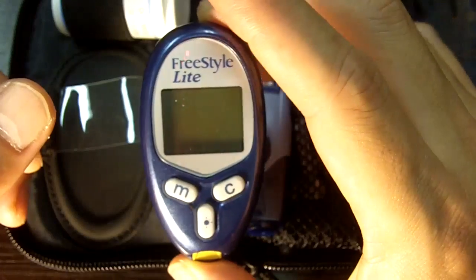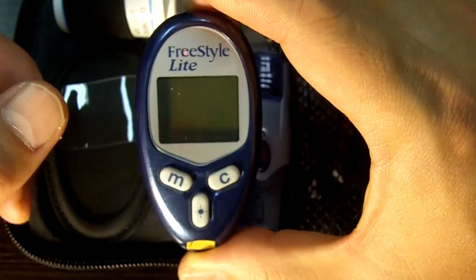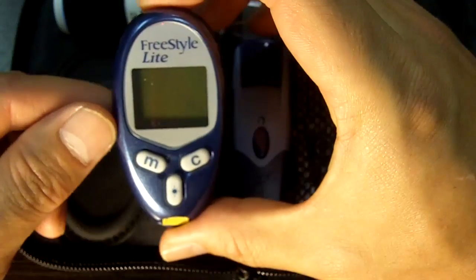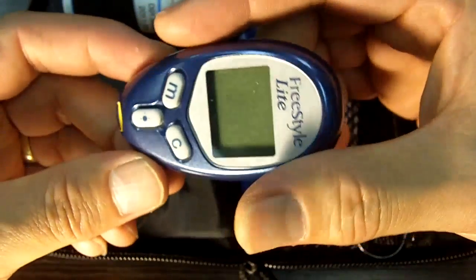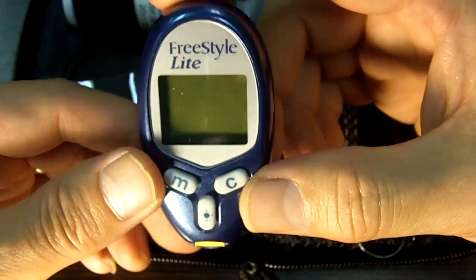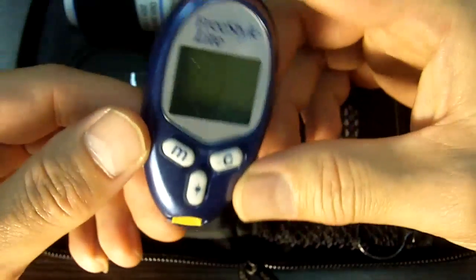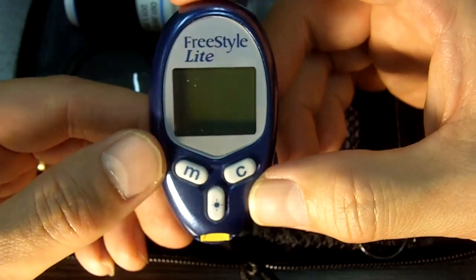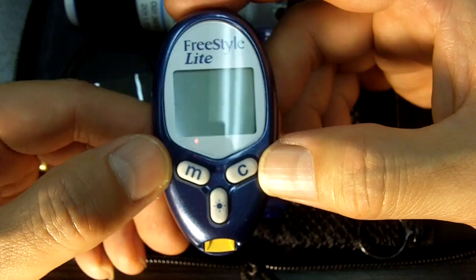Actually, let me correct that — it's .3 microliters for this meter. I should know that. It's pretty remarkable. I test with this and sometimes I'm amazed — my hands are so cold and I don't get that much blood, but I take it up against there and it gives me a reading. So again, .3 microliters is what it takes. A very, very, very small amount.